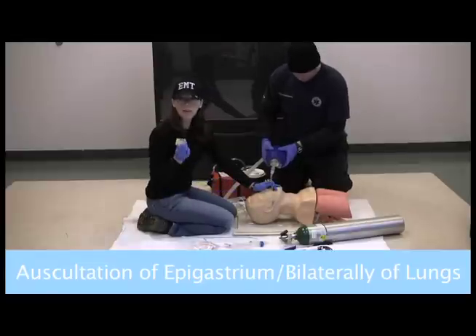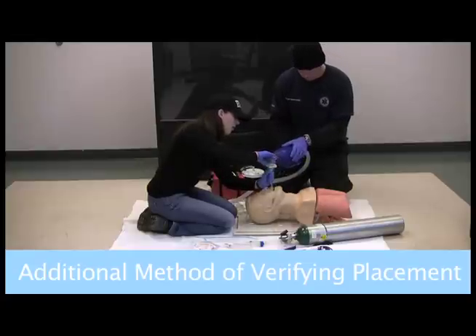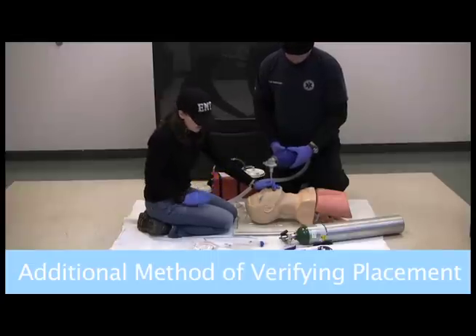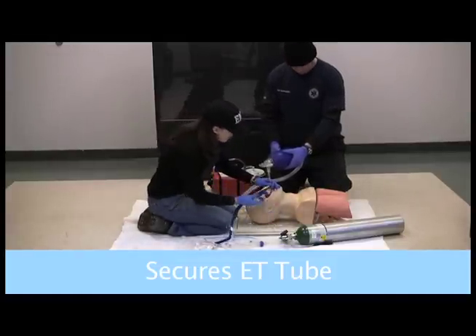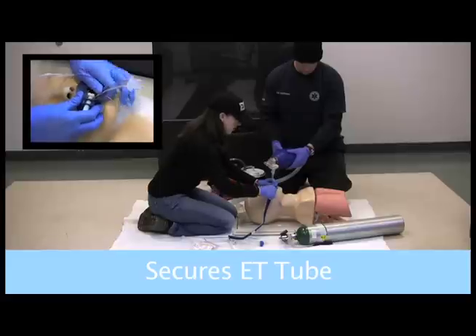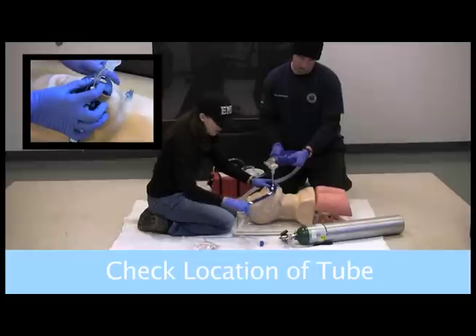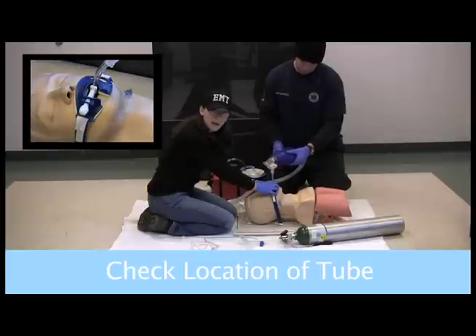I want to take my colorimetric device and attach it. Because we're intubated, we're going to be ventilating at a little slower rate — once every seven to ten seconds. I'm still holding onto the tube, so we want to get this tube secure. You can use tape or we have a commercial device here. It just tightens around the tube. I can look and I am seeing the tube at the 25 mark. I want to remember that, because if it has moved, I'll be concerned that the tube has moved.